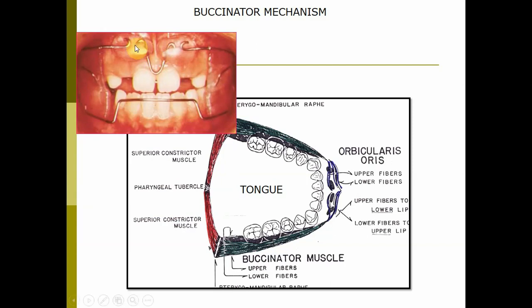If you look at the Frankel appliance, that's exactly how it works. You have your lip pads, which make the upper lip go away from the maxilla. It will not let the upper lip touch the maxilla, so the restraining effect of the upper lip will go away, and it will let the maxilla grow. That means I give this appliance when I want the maxilla to grow, to somebody whose maxilla is retrognathic. That means I give it in a class 3 patient whose maxilla is retrognathic, and this labial bow in the mandible has a mild restraining effect on the mandibular dentition.